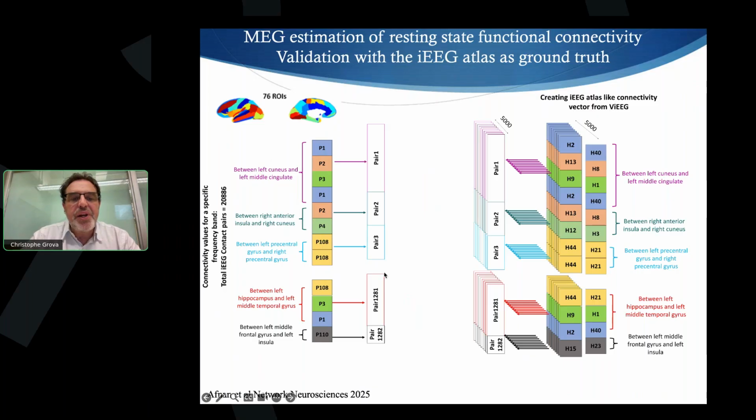And then from those pairs, I can do a connectome from the real intracranial EEG data, and I can do a connectome from MEG data converted into those exact same intracranial EEG electrodes. And then I was able to do a spatial correlation between those 2 connectomes. And because we have 5,000 values, I was able to do that 5,000 times. And then we were also shuffling the different anatomical labels to get a null hypothesis version.